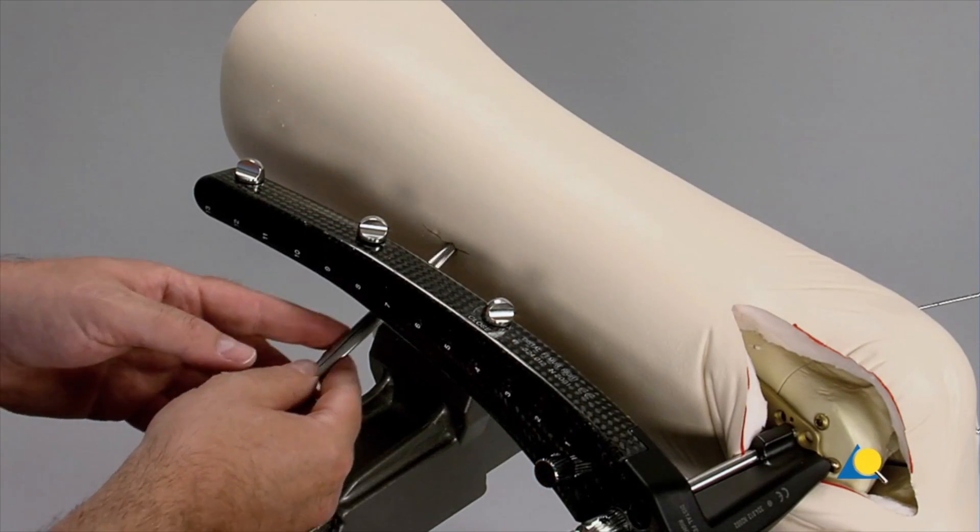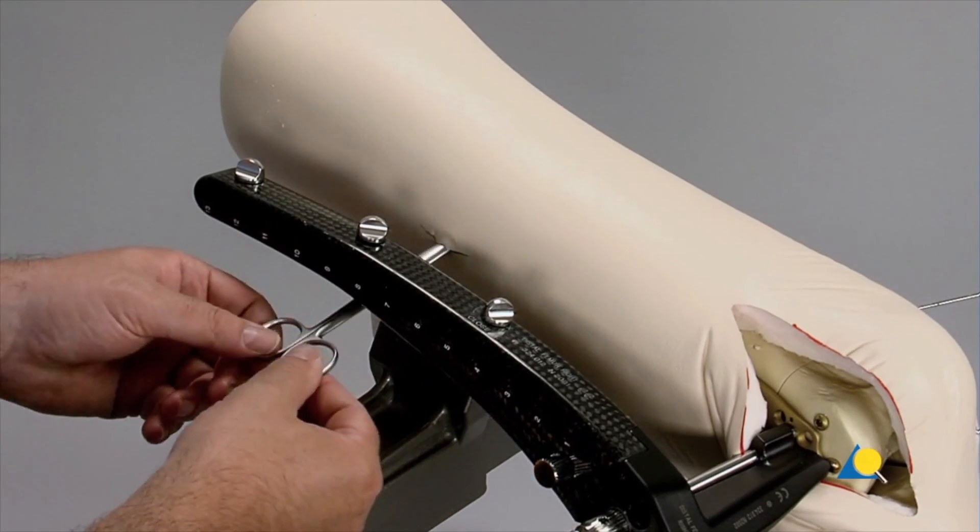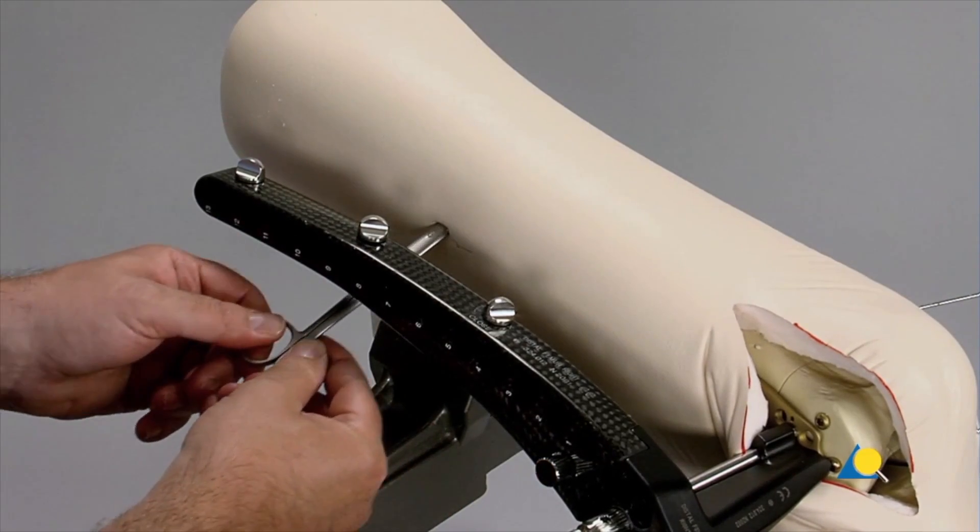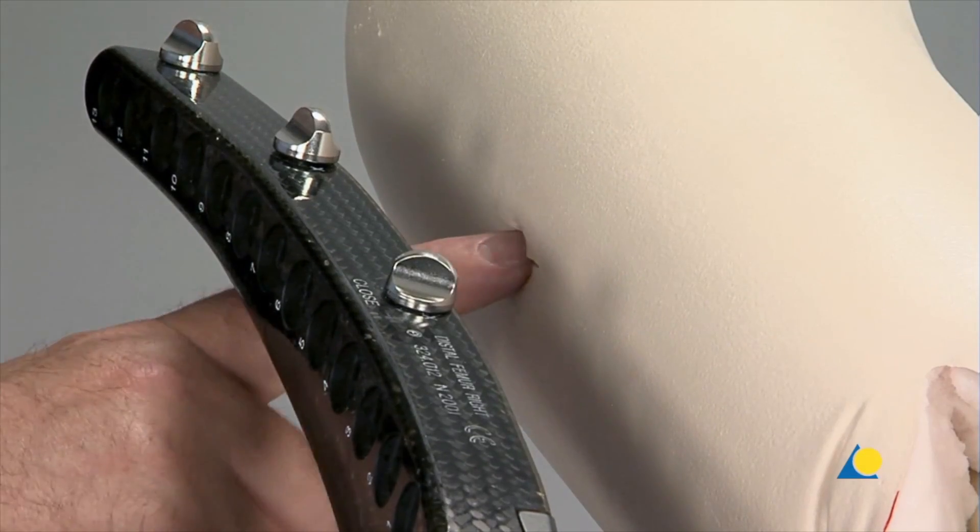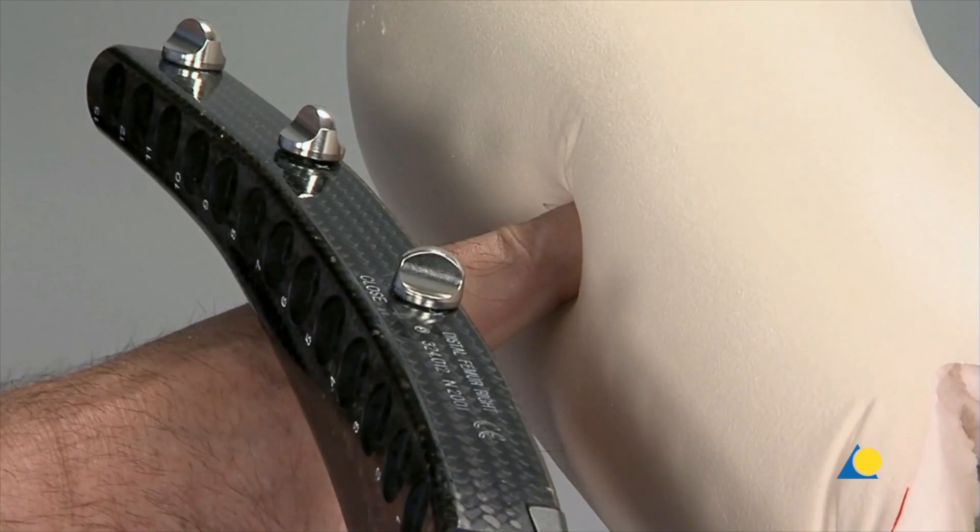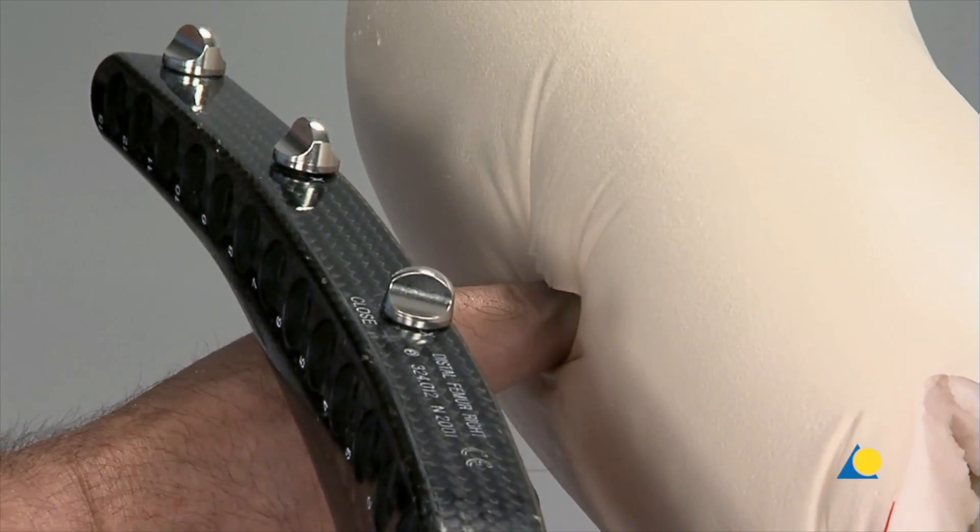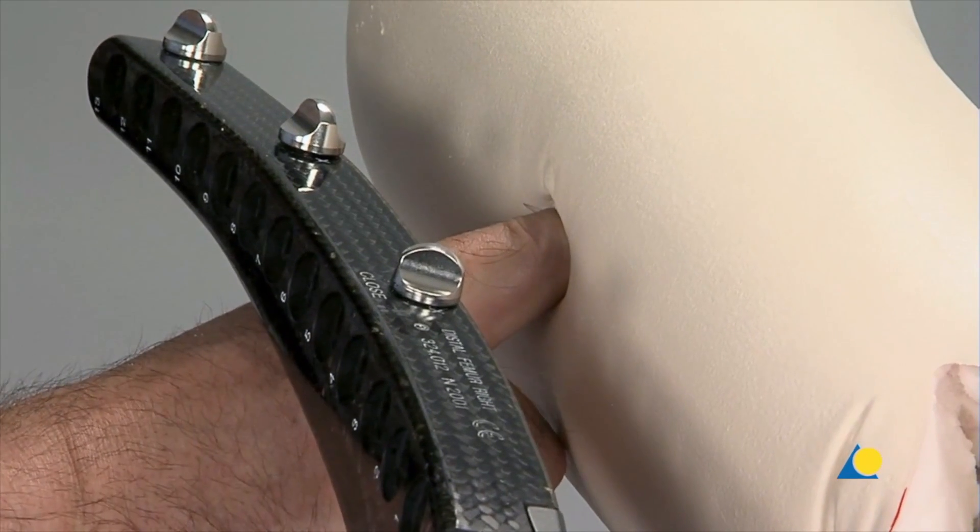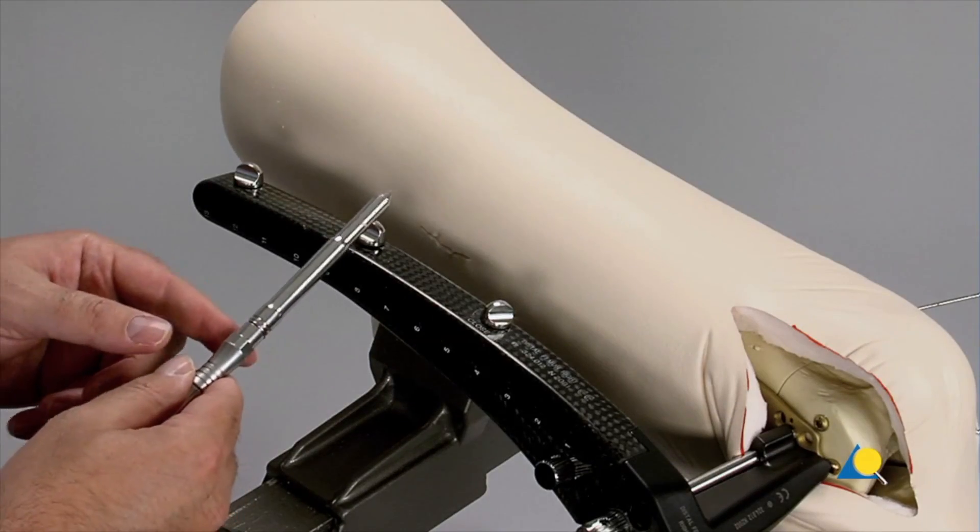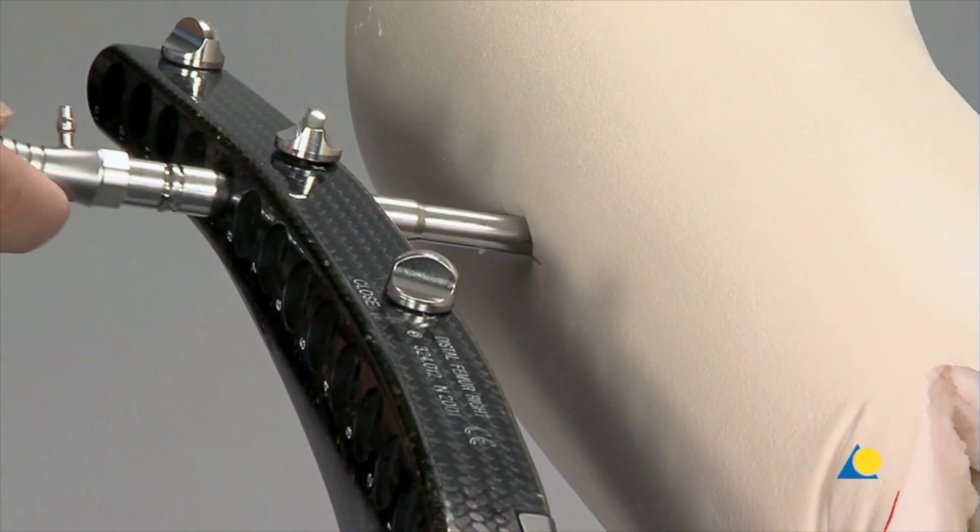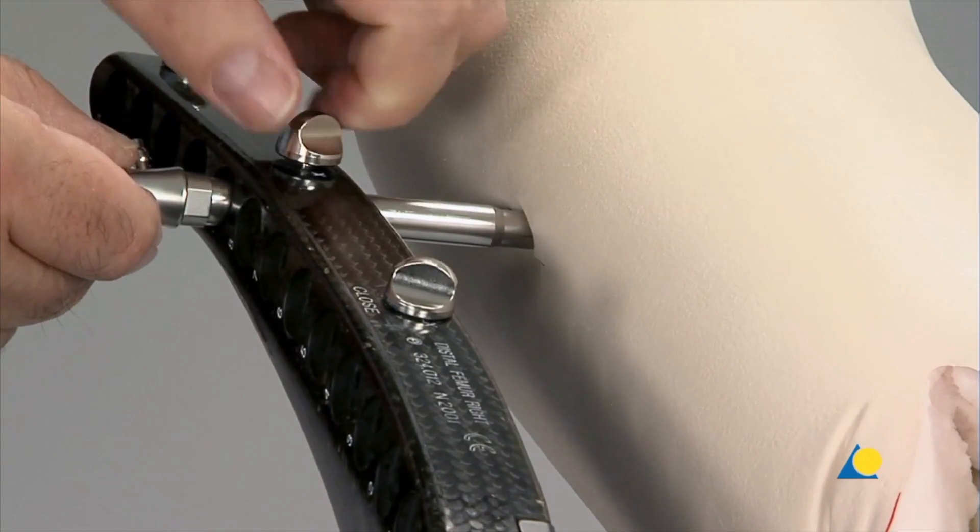In a clinical situation, scissors without sharp ends are always used, so the muscles can be spread in a blunt fashion. Here, the position of the plate is checked using a finger. The correct position is decisive for good stability of the plate to the bone. The insertion sleeve-trocar combination is inserted down to the bone and tightened in place using the nut.